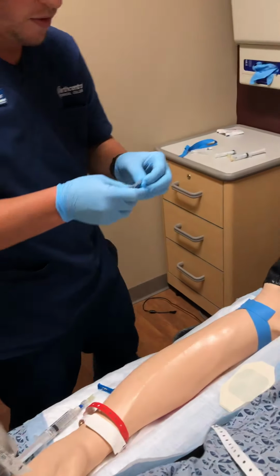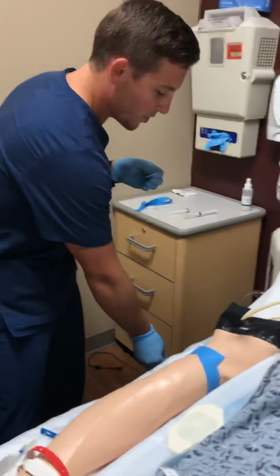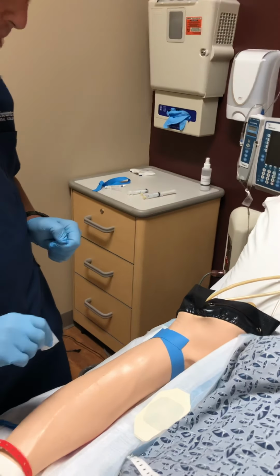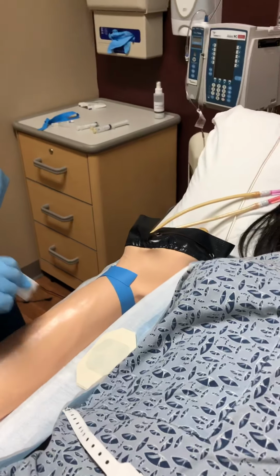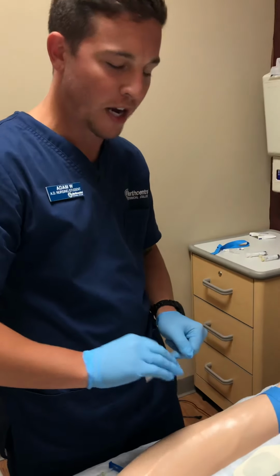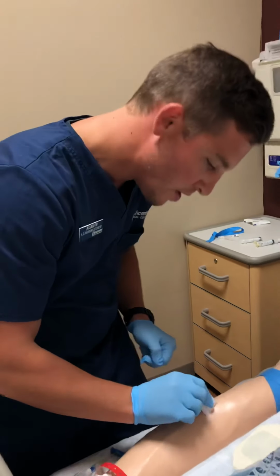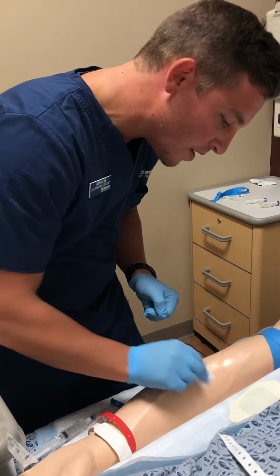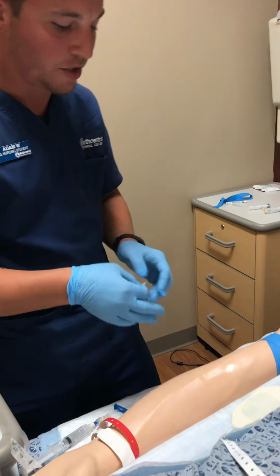So we're going to clean in a circular motion about 15 to 20 centimeters below the tourniquet. We'll put that back on right before we insert here. So circular motion right here, working outwards, up to 20 seconds. Okay, 20 seconds, we'll let this dry.